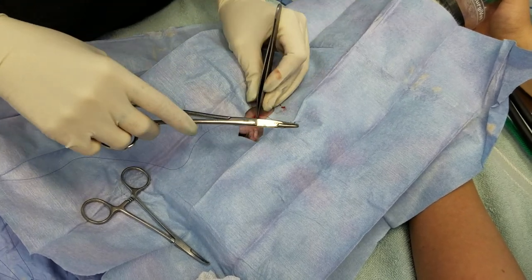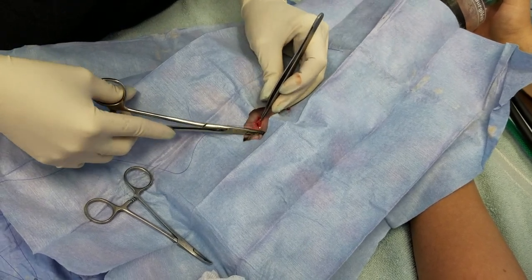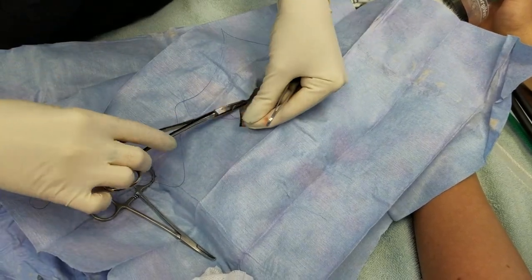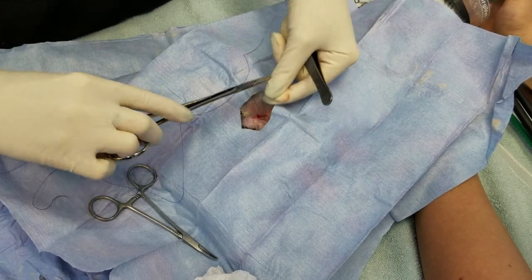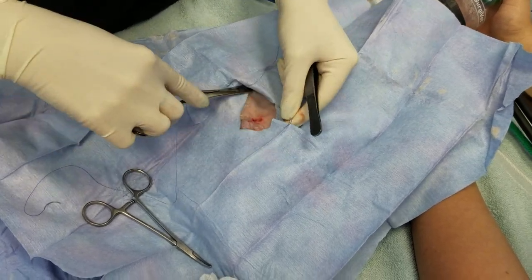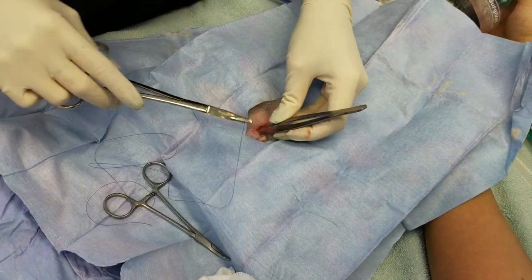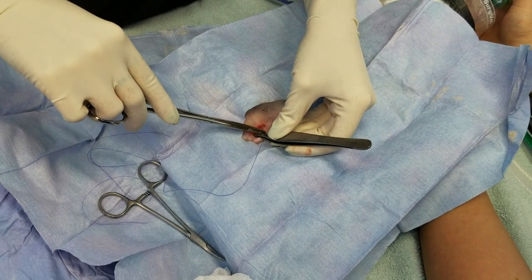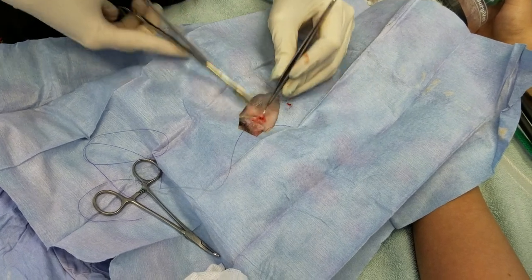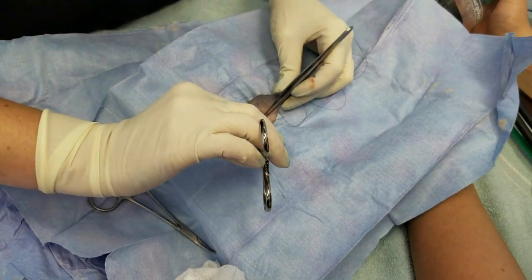I kind of do one just general opposing sub-Q, everything together. Right. And then I do a purse string intradermal and be very careful with forceps on the skin. Their skin is very sensitive. Very thin, and they tend to be prone to self-mutilation.